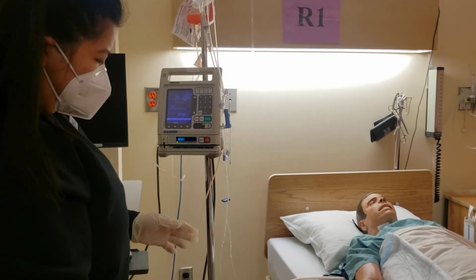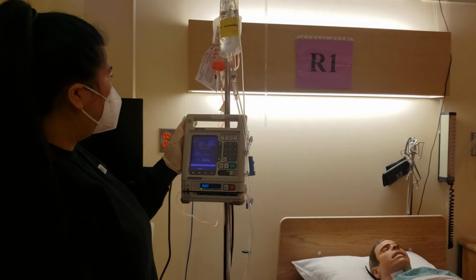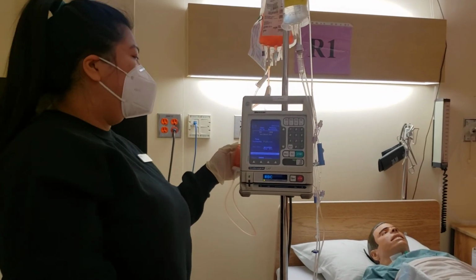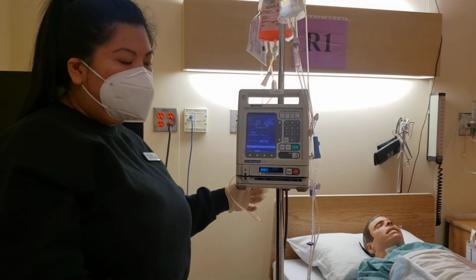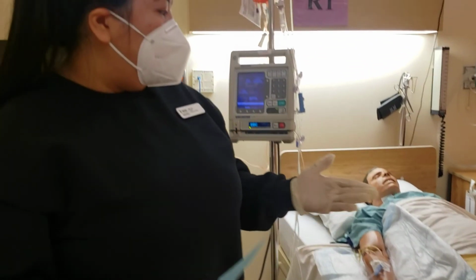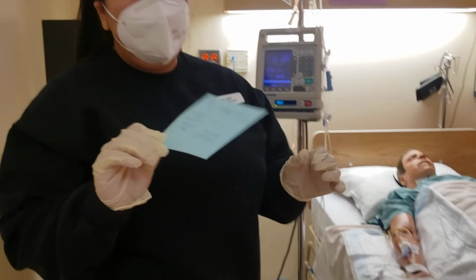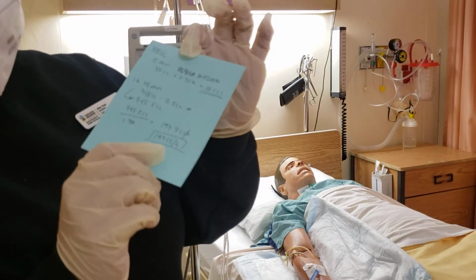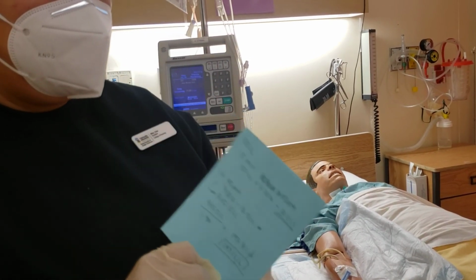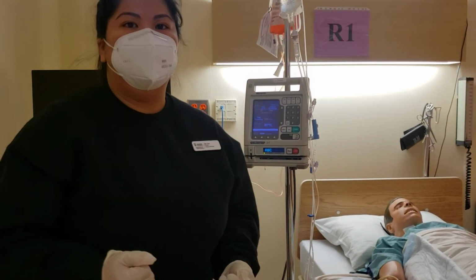Can you please state your first name and your last name? We would check for 3 drips to see that the blood product is infusing. Then I would increase the rate after the 15 minutes is up and the patient does not show any signs of transfusion reactions and their vital signs are stable. I will increase the rate to 197 cc per hour for the next hour and 45 minutes. And then I would also record on the cumulative blood product record. That's it.